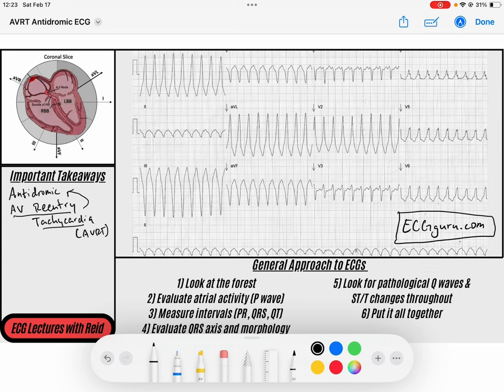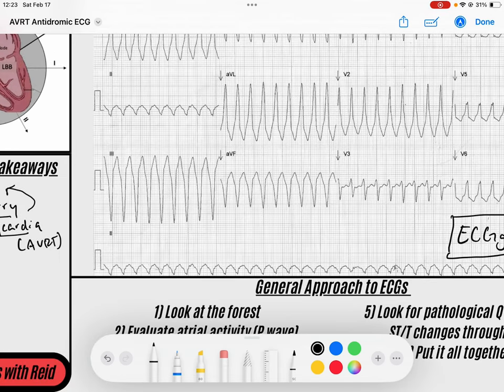So let's jump into this rhythm. When we're talking about antidromic AV reentry tachycardia, we're going to see that this is a subtype of a supraventricular tachycardia. As you look at this ECG here, you see we've got a very regular occurring QRS complex. It is incredibly fast.